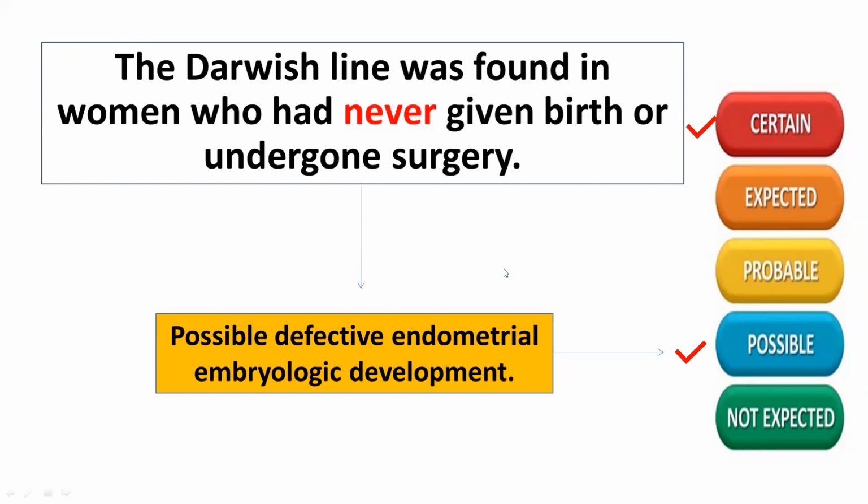But why is it seen in patients who did not get any delivery or had no previous operation? Possibly it is signifying possible defective endometrial embryologic development.